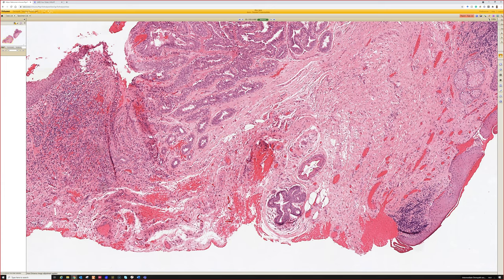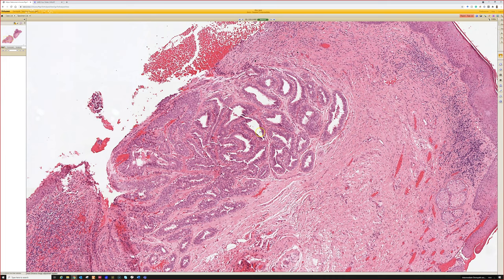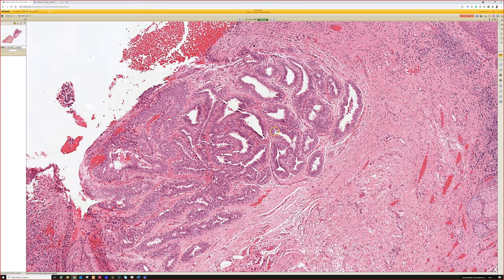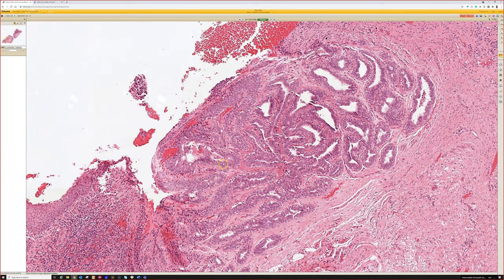So when you see apocrine glands, think of anogenital area, axilla, maybe near the nipple you can have them. You can also see apocrine glands in the eyelid, the glands of Moll. But you don't see them in many other places. So in this case, we would be in the vulva. And this is a lesion made of multiple ducts and tubules closely packed together. And you will usually see papillary projections sticking into the lumen of this.